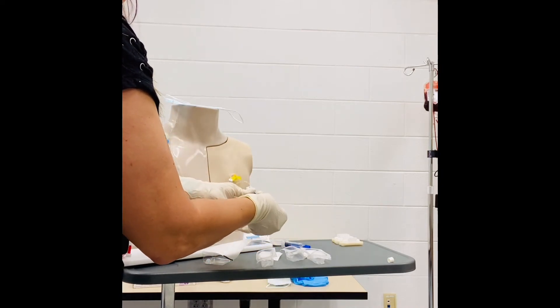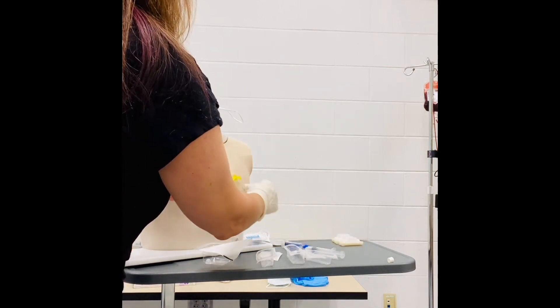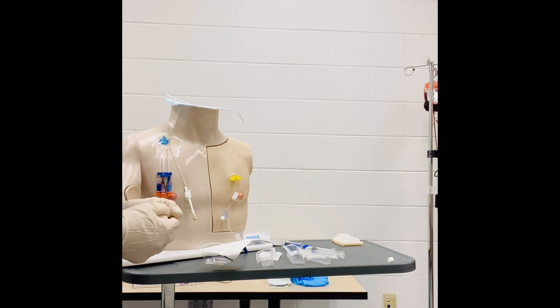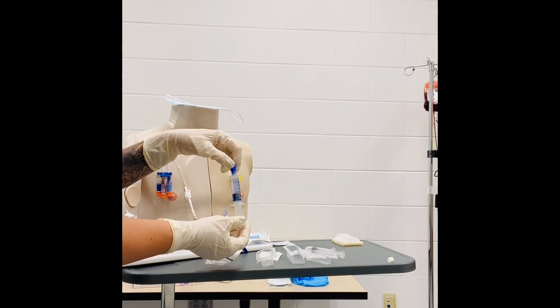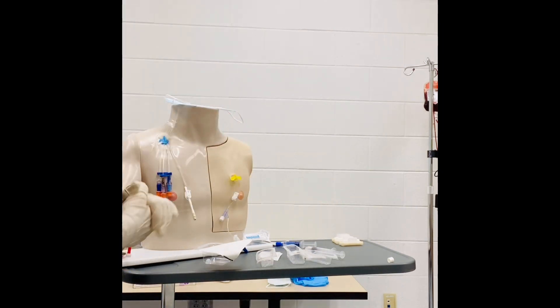Now everything is on. We can put our Tegaderm on, and you would want to cover that with a bio patch as well if your facility calls for that. Once you have that on, you can either connect your patient to their IV fluids that have been ordered, or if it is just ordered to stay locked, you would want to use 2.5 of heparin, doing that in the same manner with your push, pause, push, pause, locking that off at the end of your push to maintain positive pressure. Ensure that your patient is comfortable, clean up your area, document how the patient tolerated, and any significant findings during the procedure. And that is all for inserting a Huber needle.